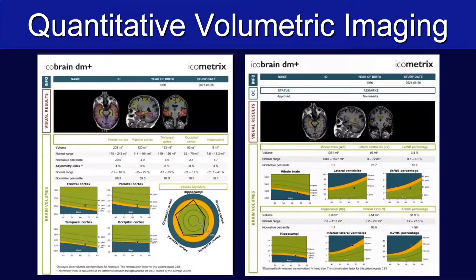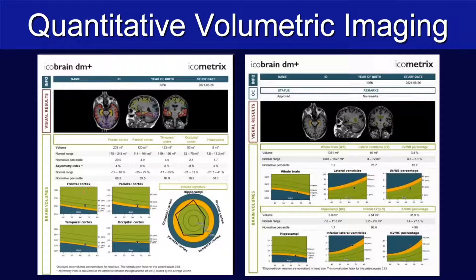This is a dementia report from a different company, again giving us the volume of pertinent structures, including the different lobar cortices as well as the hippocampi, and their normative percentiles in both pictorial graph and bullseye representation.